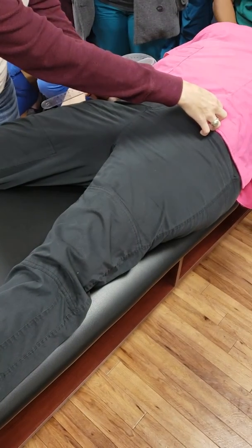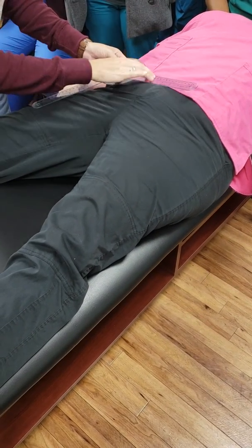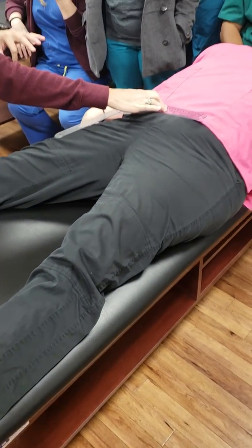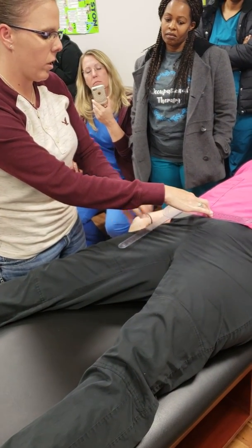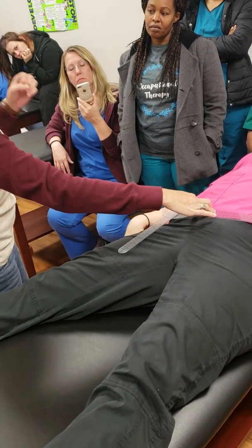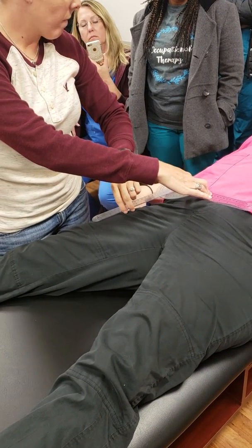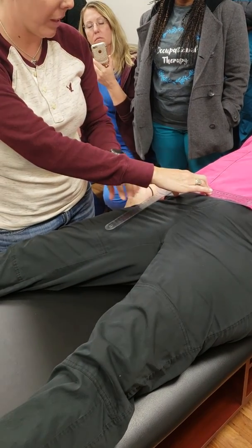And again, ASIS, now it's here, so I just move it a little bit. The difference with this one is the position where the goniometer starts. We started at 90 here. If you noticed, this is a 90-degree angle. That's your 0, so we zero it out. They'll be confused about that. Does that make sense? Yes. So we started at 90, but that's 0.